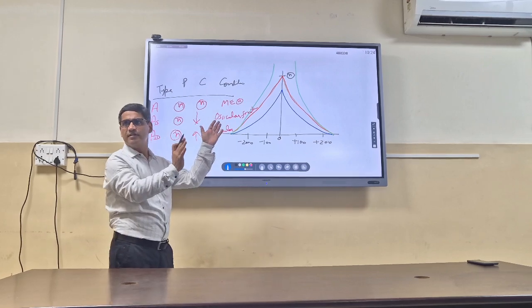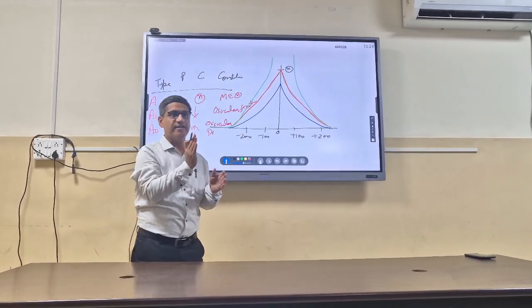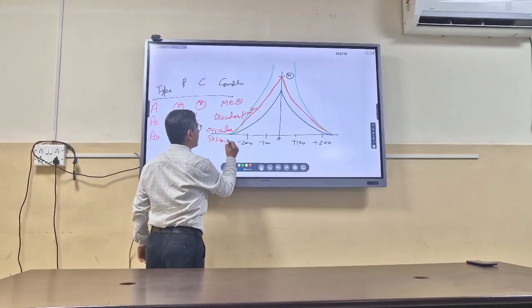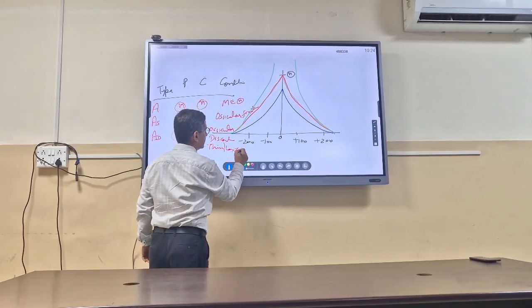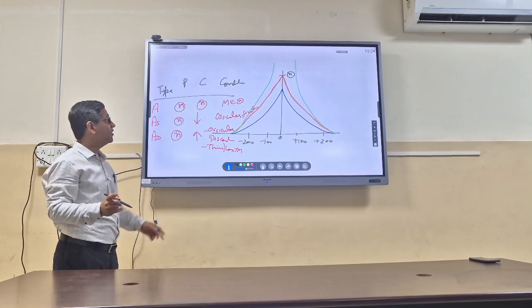All sound goes in. Or if the tympanic membrane is very thin and lax, so that it is not able to reflect much sound, rather it allows sound to enter. So either in ossicular discontinuity or thin or lax tympanic membrane. Got it? Clear up till now?